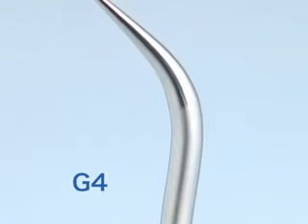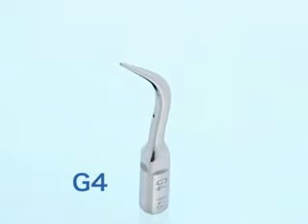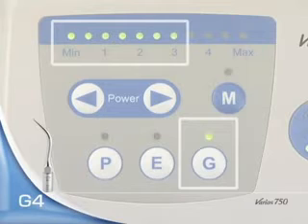Tip G4 is used with Varius 750. Power is set at G-mode, minimum to 3.